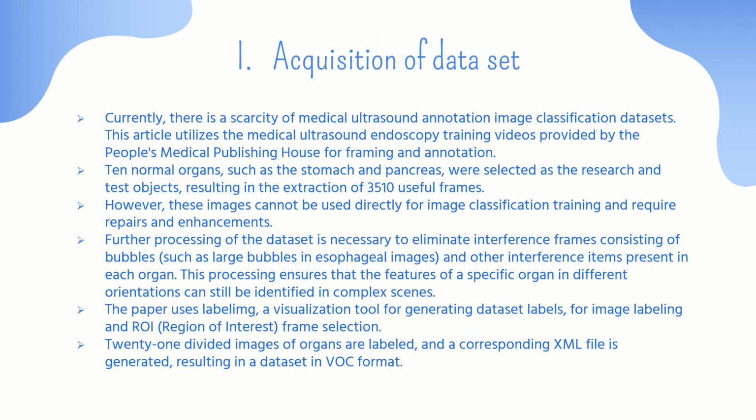Coming to the acquisition of the dataset, at present there are very few datasets of medical ultrasound annotation. So this article is based on the framing and annotation of the medical ultrasound endoscopy training video of People's Medical Publishing House. The video data contains the medical classification and annotation of dozens of endoscopic images, including gallbladder, pancreas, etc. It provides an image source for the construction of the dataset.